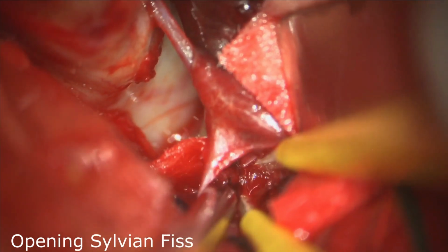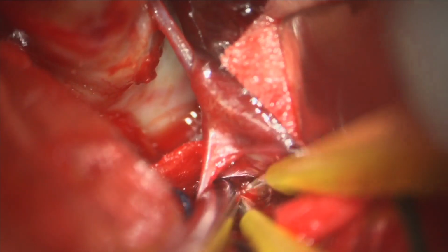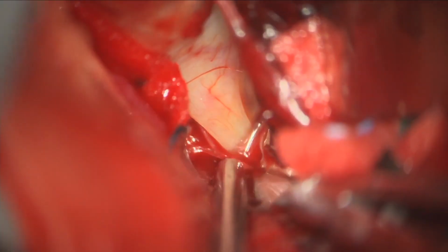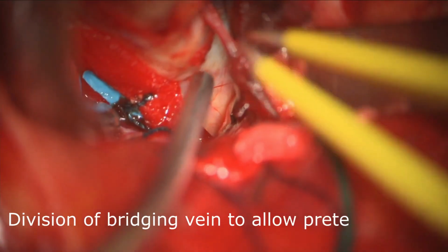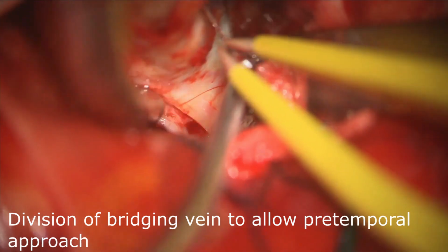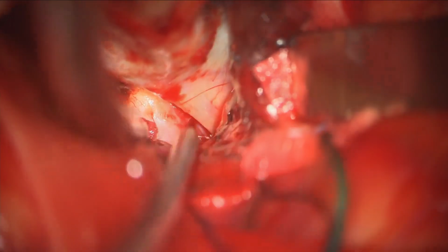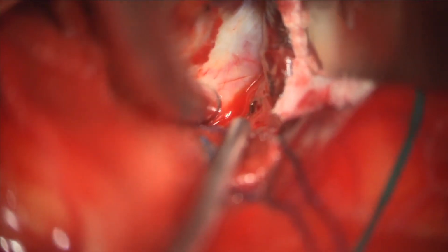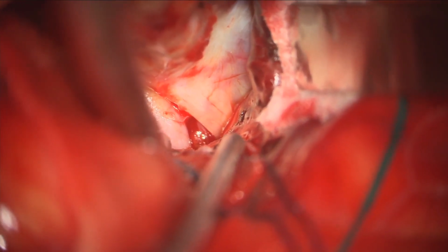We then turned our attention to the Sylvian fissure, which has to be widely split in order to use this approach. The Sylvian fissure was very thickly filled with blood. To retract the temporal lobe, bridging veins from the temporal lobe to the sphenoparietal sinus must be coagulated and divided, which is generally well tolerated. And after this, the temporal lobe can be retracted posteriorly and laterally to widen the pretemporal space.